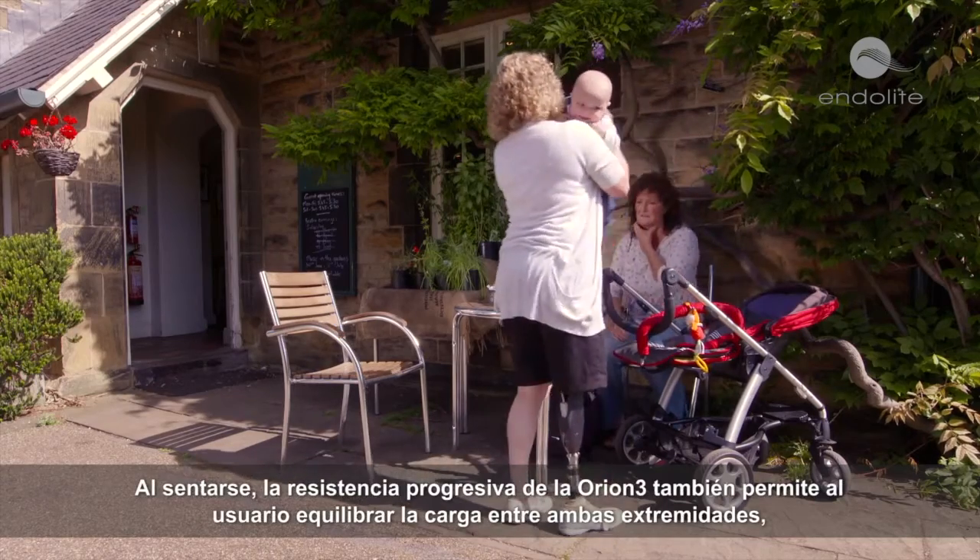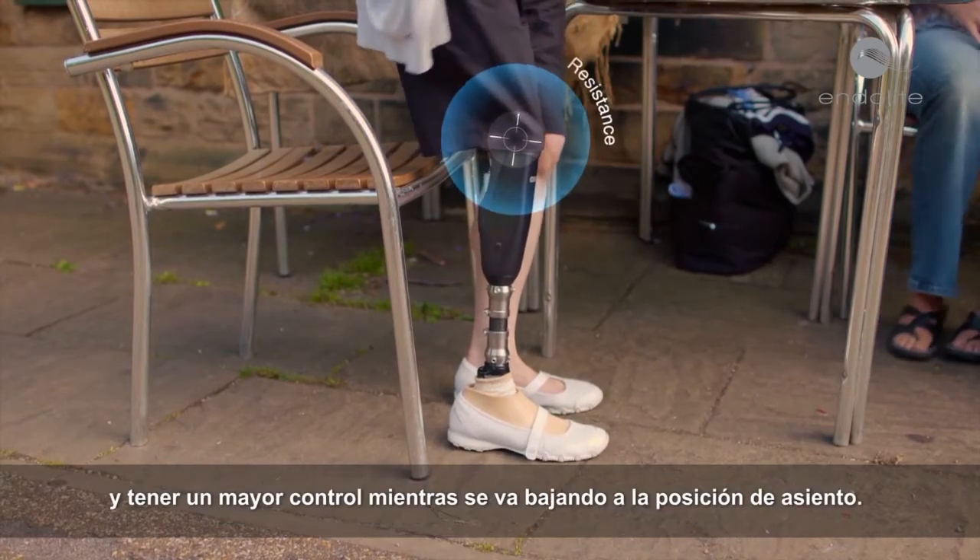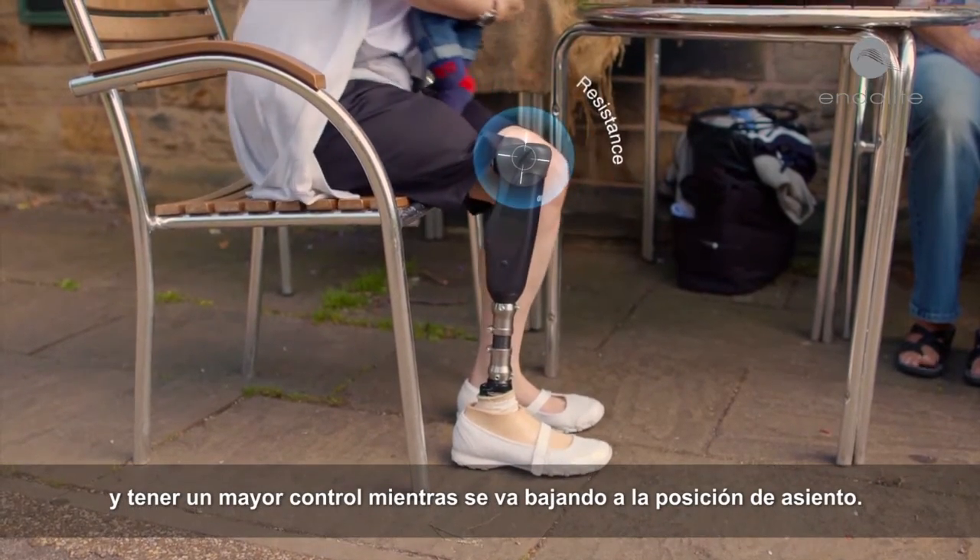When sitting down, Orion 3's progressive resistance also allows the user to balance the load through each limb and to have greater control whilst lowering themselves into a seated position.